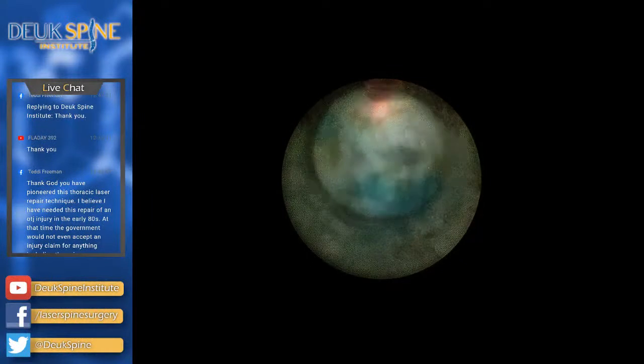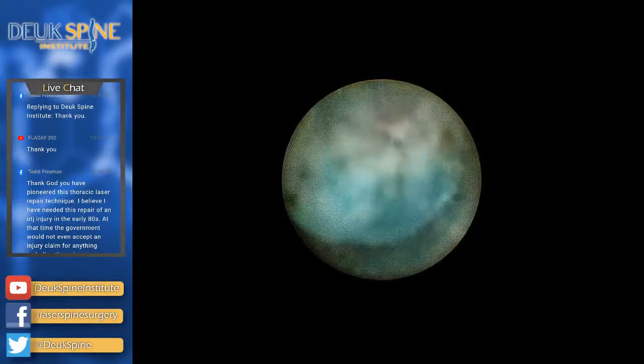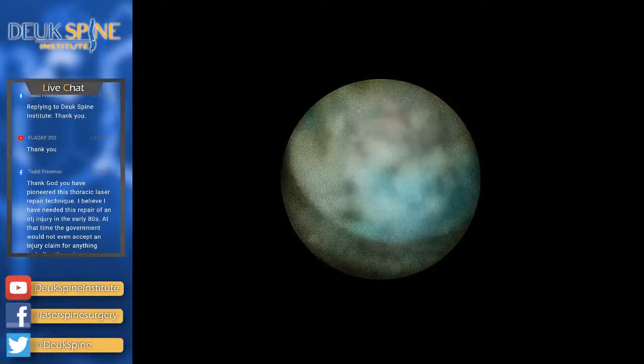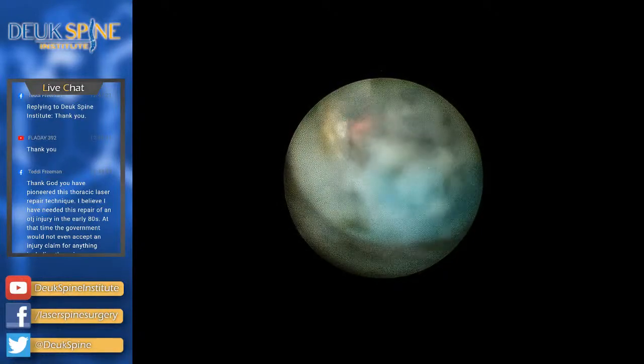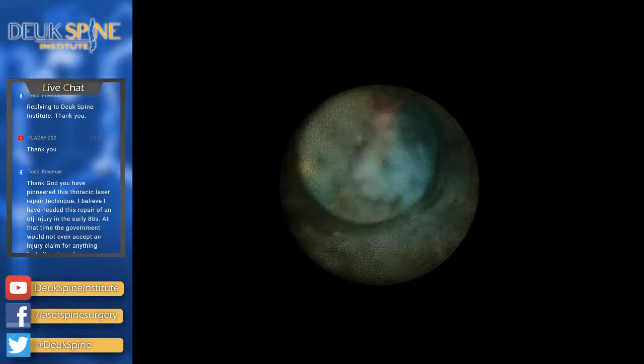So we're in this disc, we're zapping away pieces of the herniation right here. And it's a process. So to pass the time, we talk about medicine and other interesting things.